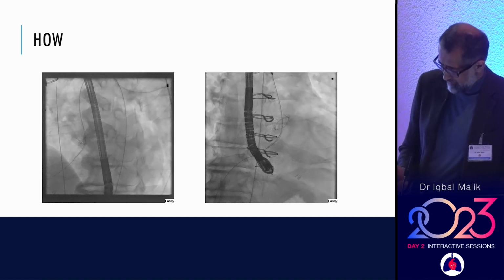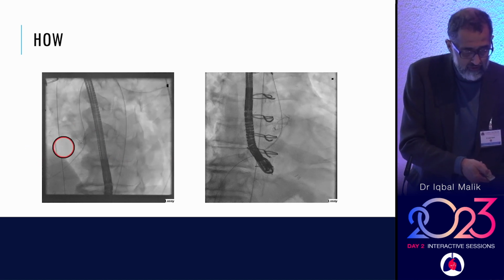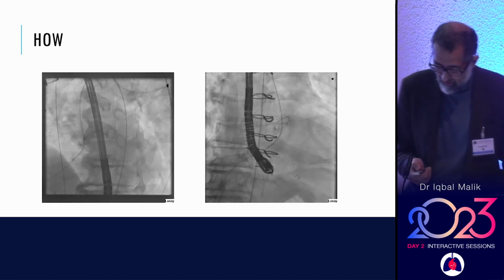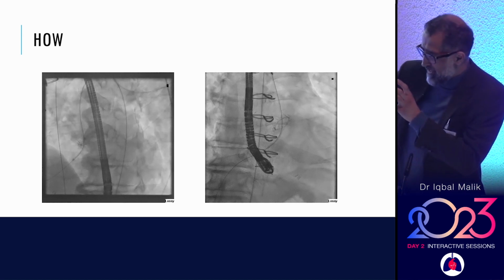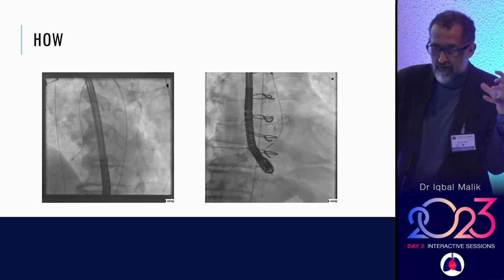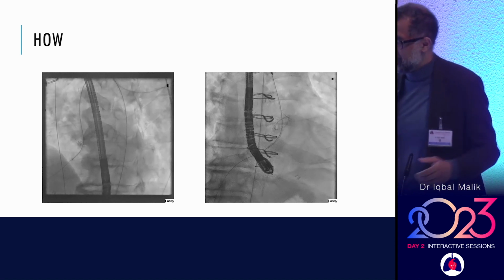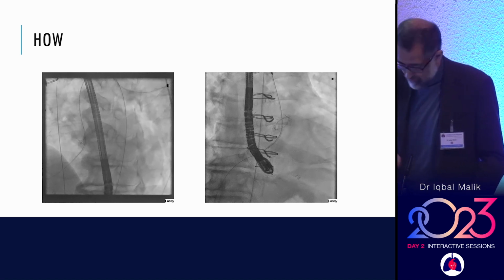So in effect, we've got a catheter that I've managed to swing through the hole. So you can see the AVR is around there, and then the catheter's gone through the hole on a wire, and then I'm creating a rail, because I want to deliver my kit from the RA to the LV. So I get a big plug that can plug from the LV side and leave something in the RA side rather than the other way around, okay? Because the pressure will always push the device into the RA. So if my big disc is on the LV side, it doesn't matter because it's not going to go through. So we want it that way around.